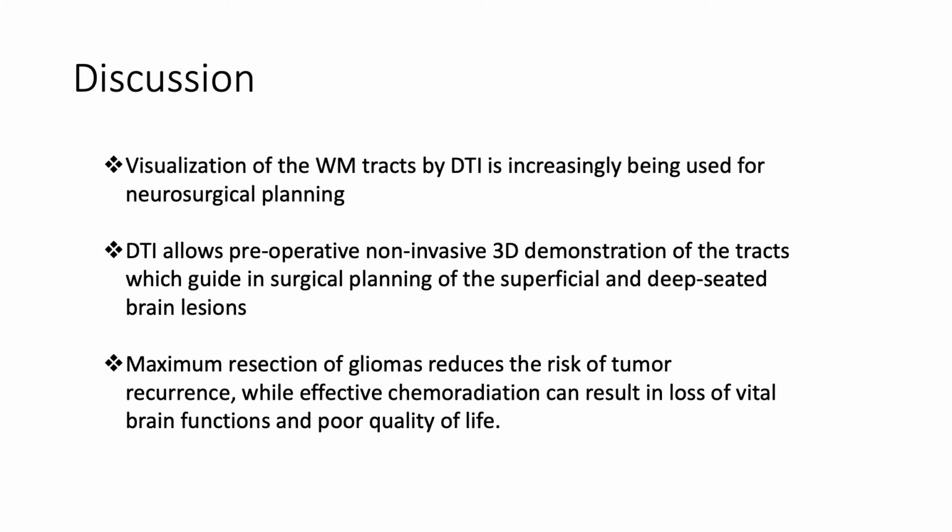DTI can be acquired in intraoperative rooms, and in some cases preoperative unidentifiable CST were trackable on intraoperative scans due to change in local mass effects by tumors on adjacent tracts. DTI-based surgical planning in selective patients can represent an alternate procedure to awake surgery that is often used today.